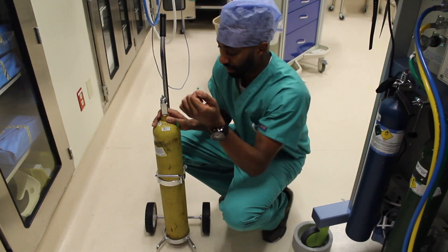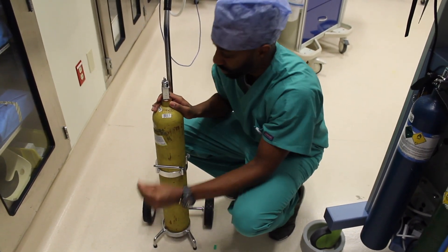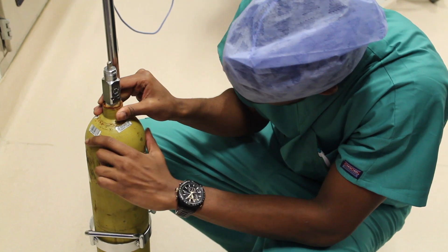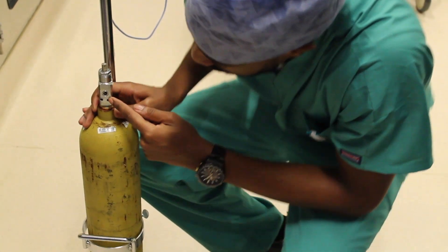We're going to pop this. You should have a washer that you keep, because you may need this when you take it to the back of the machine. Notice everything is clear, no debris anywhere. You can see that your pin index safety system is here.